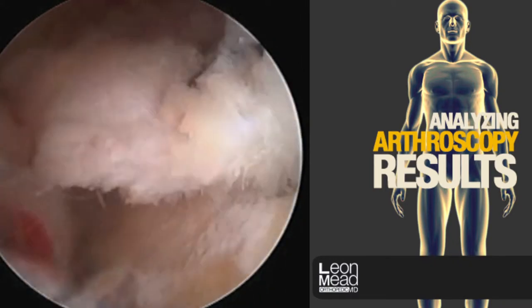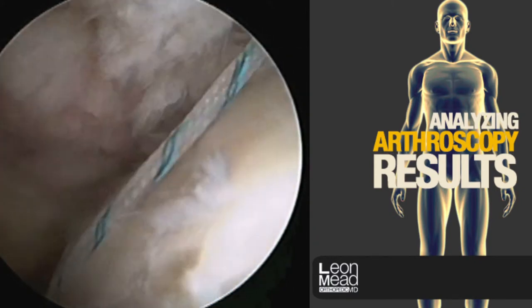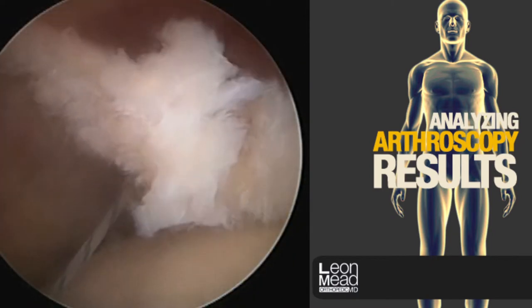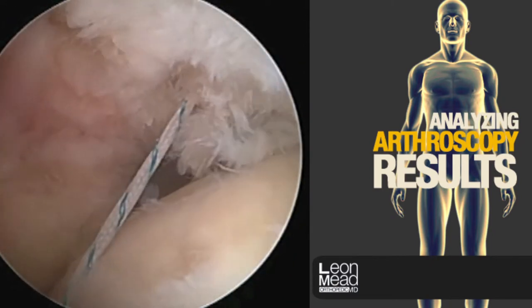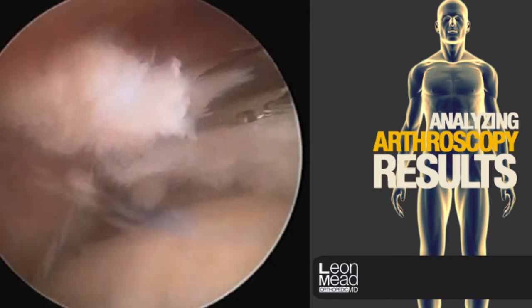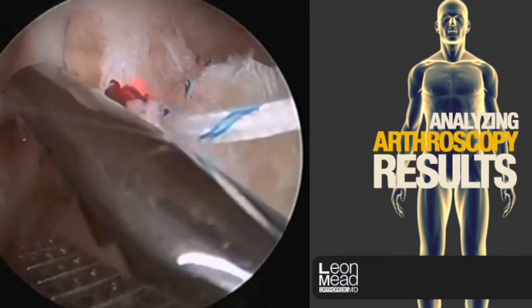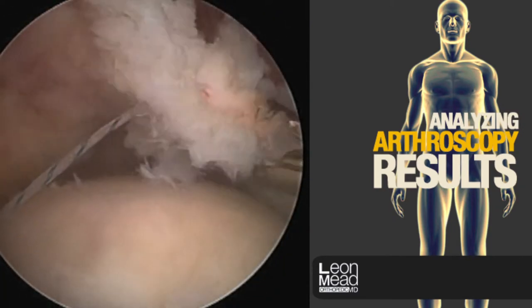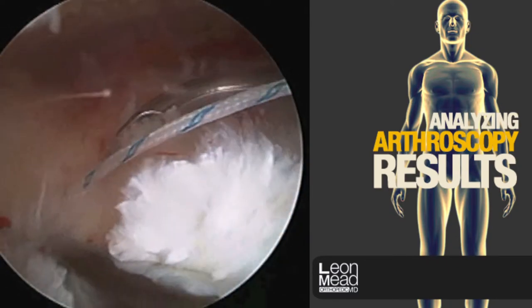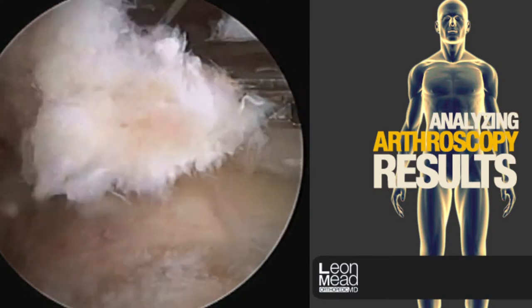Now we've grasped another part of the cuff that is torn — this is a fairly complicated, complex tear. All the sutures are passed first, so there has to be a lot of planning. We'll grasp the cuff several times to make sure we like where it's going, then pass our sutures through it. We want to make sure there's minimal tension so the sutures don't cut through the rotator cuff itself or break.